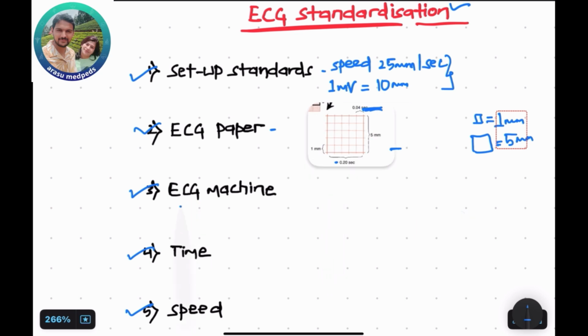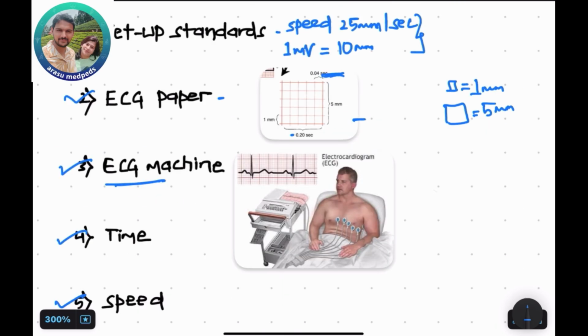What they did was connect an ECG machine to a person to record the waveforms and see how they appear. They started recording the waveforms on the paper. They observed a clear-cut pattern, with some waves forming which are recurrent, the pattern getting repeated. They noticed this first when they started recording cardiac activity.